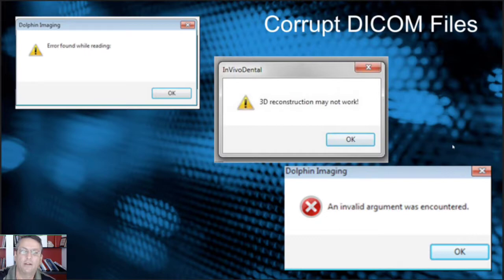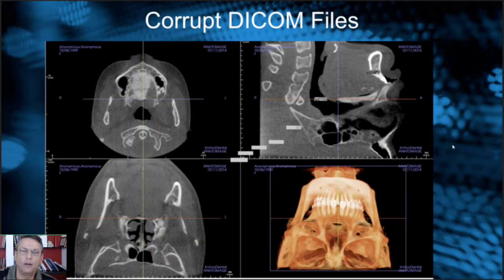They say that they can't read your DICOM. Sometimes I'll get corrupt DICOM where it'll flip it backside, upside down, doesn't load the CT data correctly. It gives an error in the software and it crashes. I just want to go over some of those things.